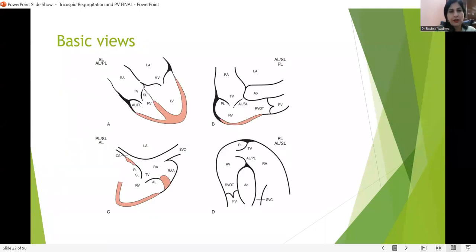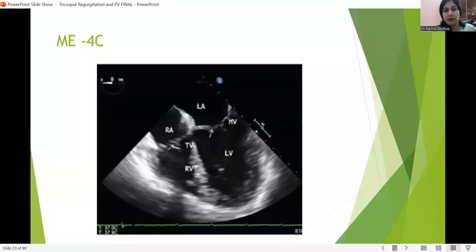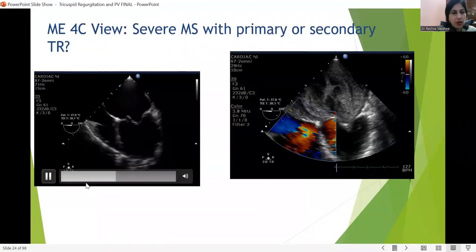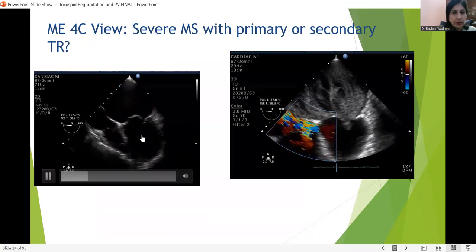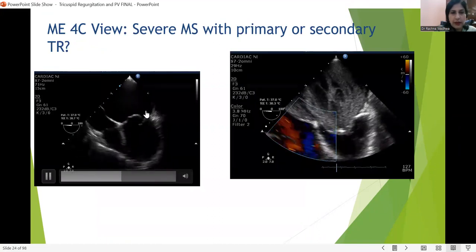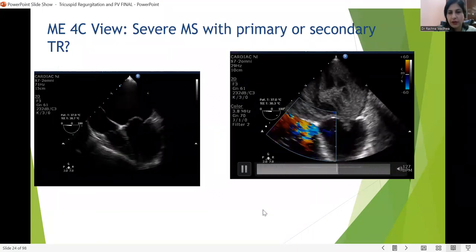The four-chamber view shows all four chambers with the tricuspid valve — also known as the right atrioventricular valve. This first view shows a pathology of severe mitral stenosis: we can see LA dilatation, spontaneous echocontrast, and massive TR on the right side.